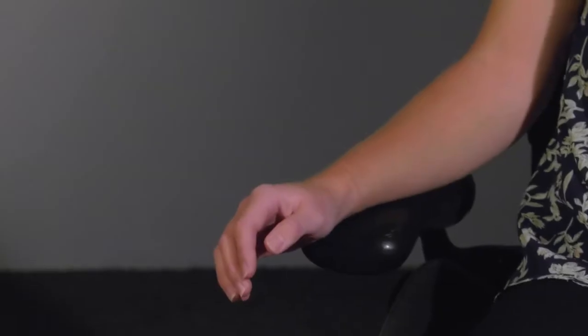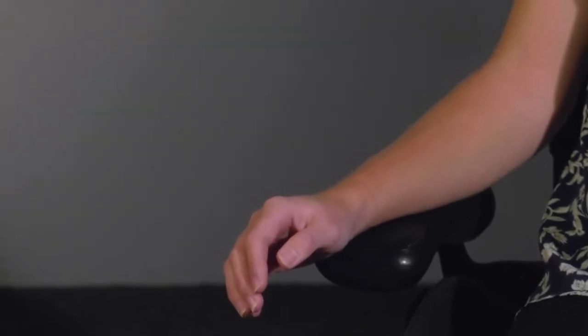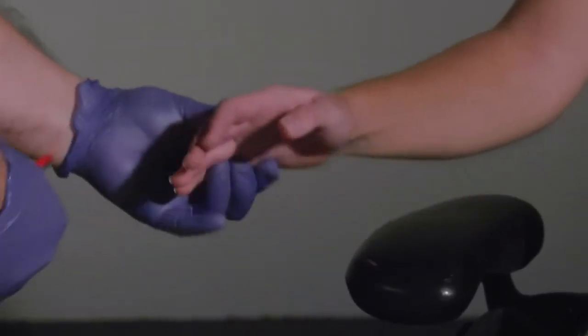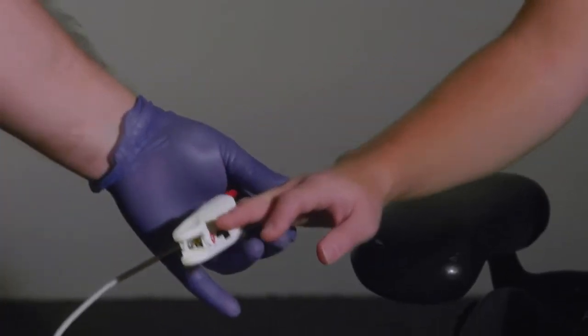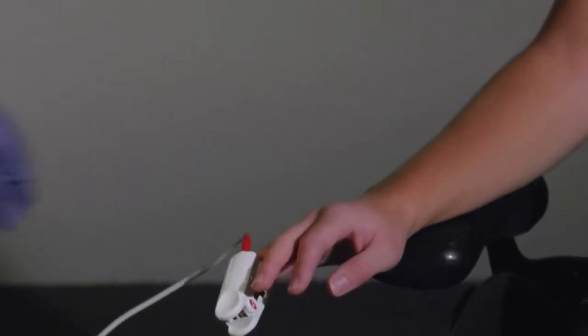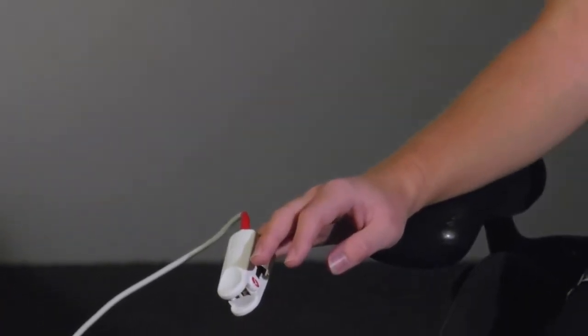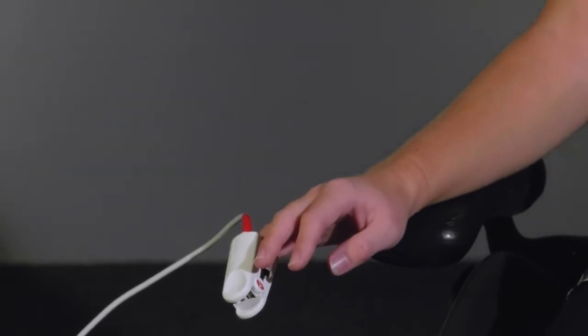Choose a site to apply the appropriate sensor. The site should be well perfused. The ring finger or middle finger of the non-dominant hand is preferred, but other sites may be used as necessary.